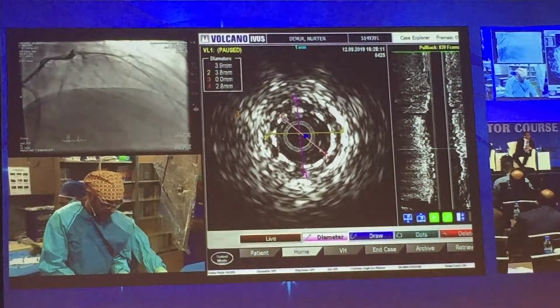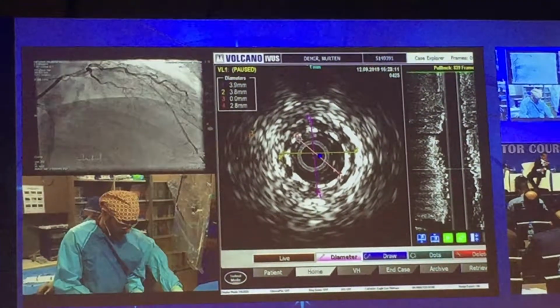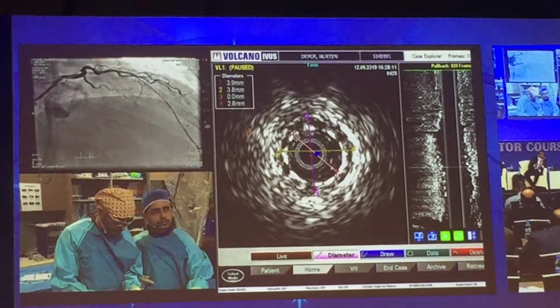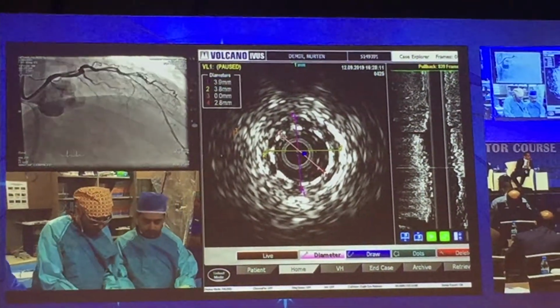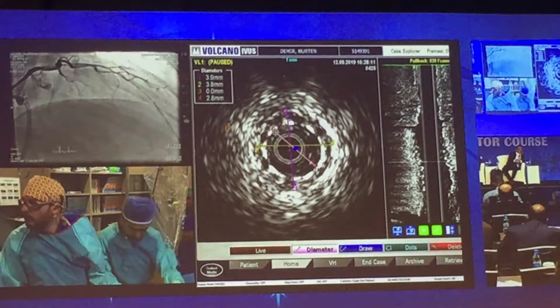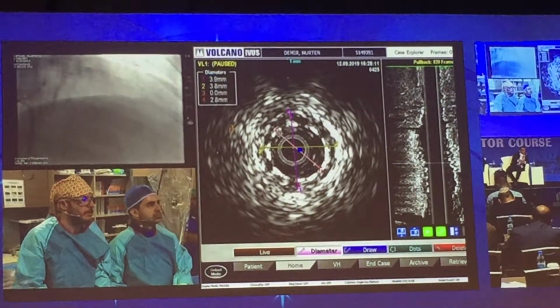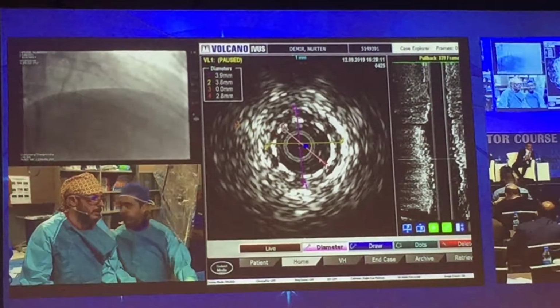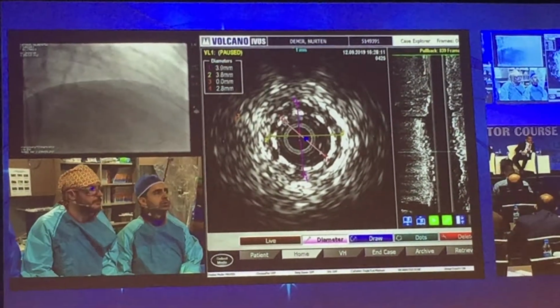My solutions are there. Do you have any comments about this lesion? I think IVUS is important to assess the distal segment of the LAD. He can assess the plaque burden. If it's more than 40% plaque burden in the distal segment, he has to cover all this area with an extra stent, or starting from the distal segment. If it's only spasm or just related to the occluded vessel, and this will grow with time, and the vessel will dilate again, so he can leave it. But IVUS here will help us a lot in this area.